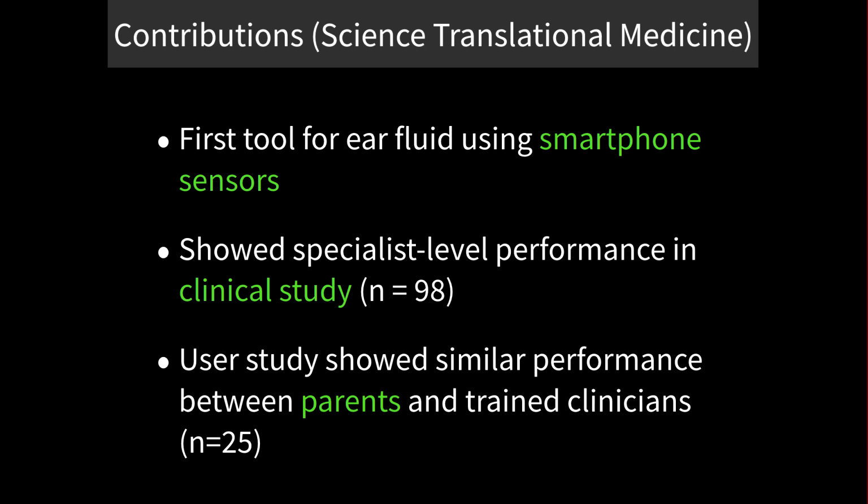We present the first tool for detecting middle ear fluid using just the sensors from your smartphone. And I'm very excited about this work because it was published only just yesterday in Science Translational Medicine. We conducted a clinical study on 98 patient ears and found we could get accuracies comparable to specialist tools. And we also ran a user study on parents, showing that parents could get the same accuracies as trained clinicians.